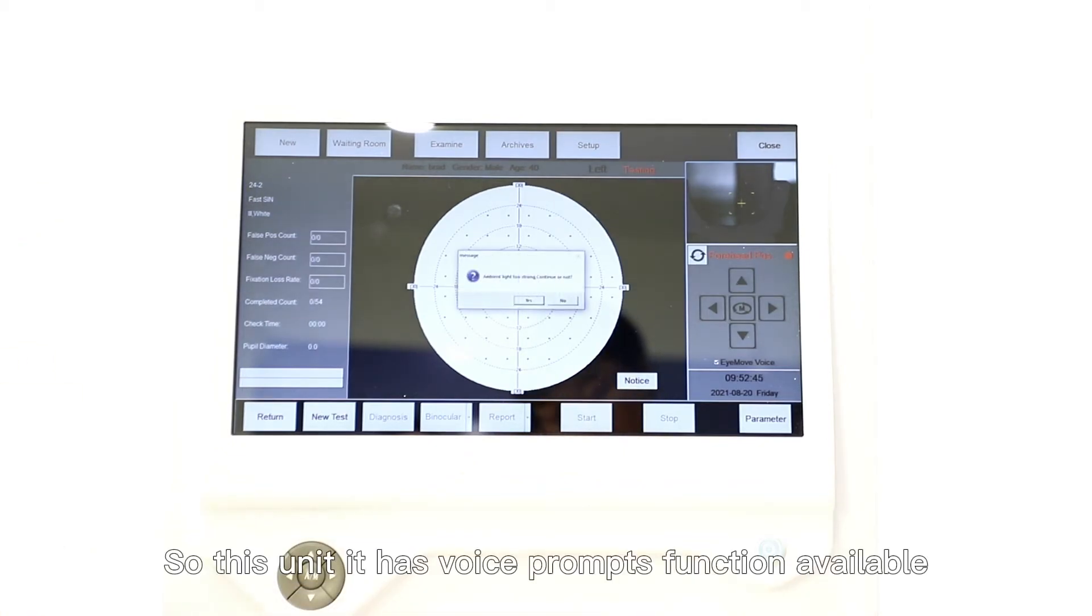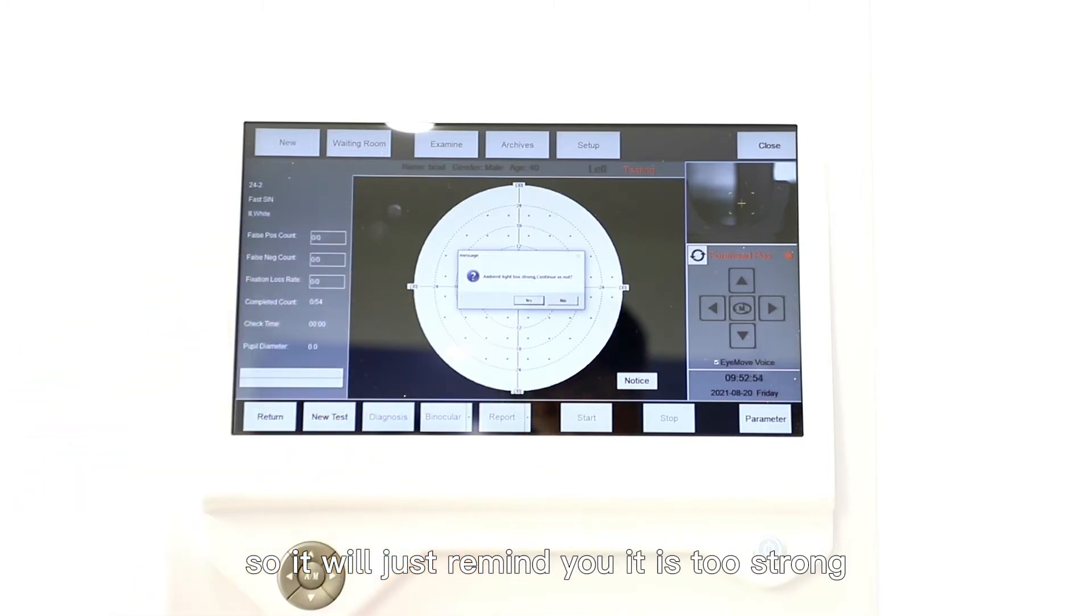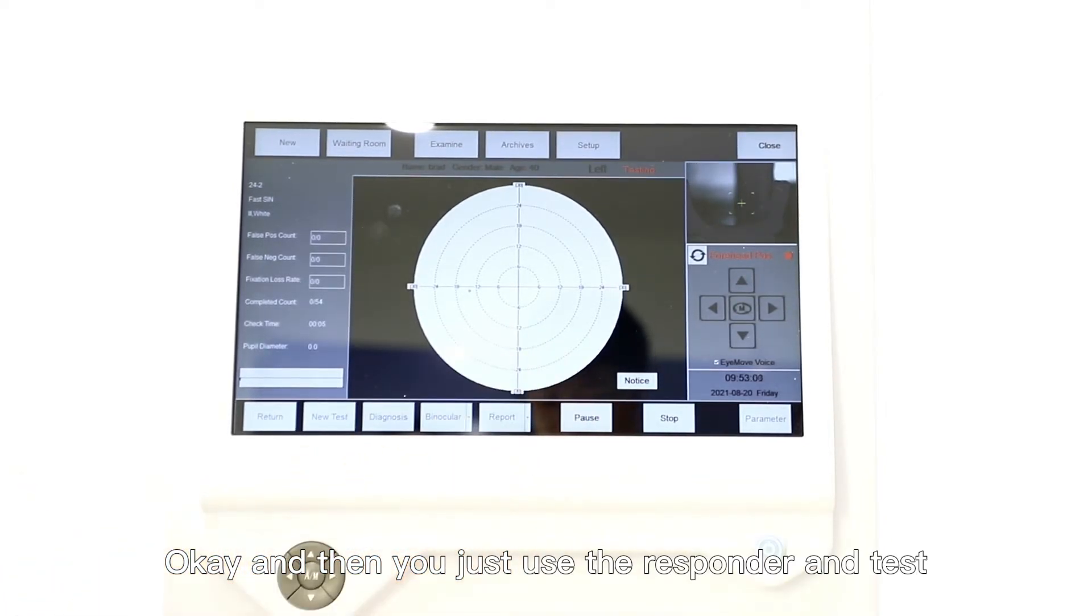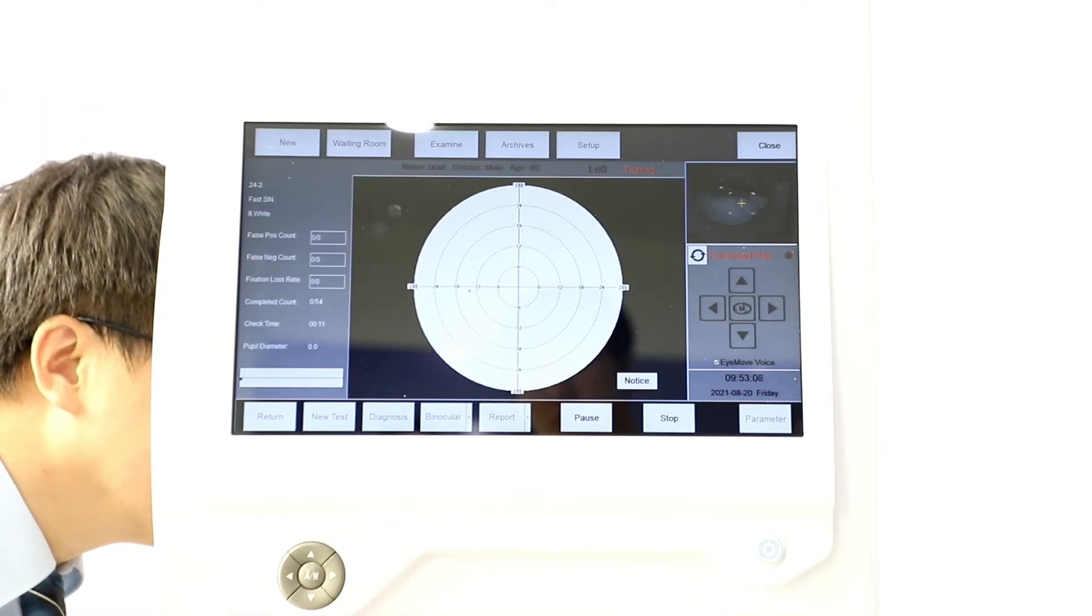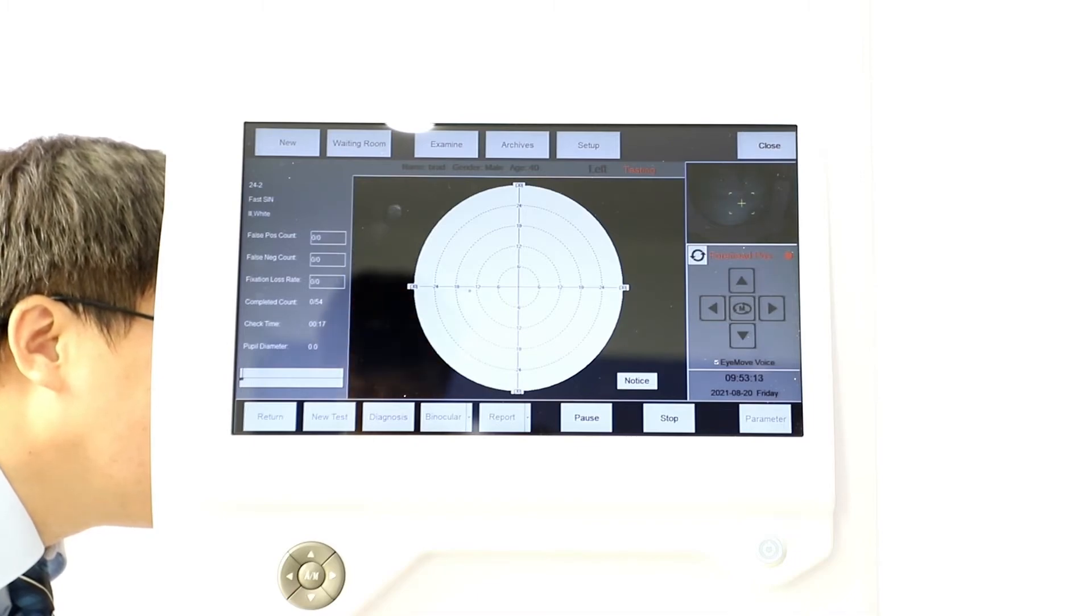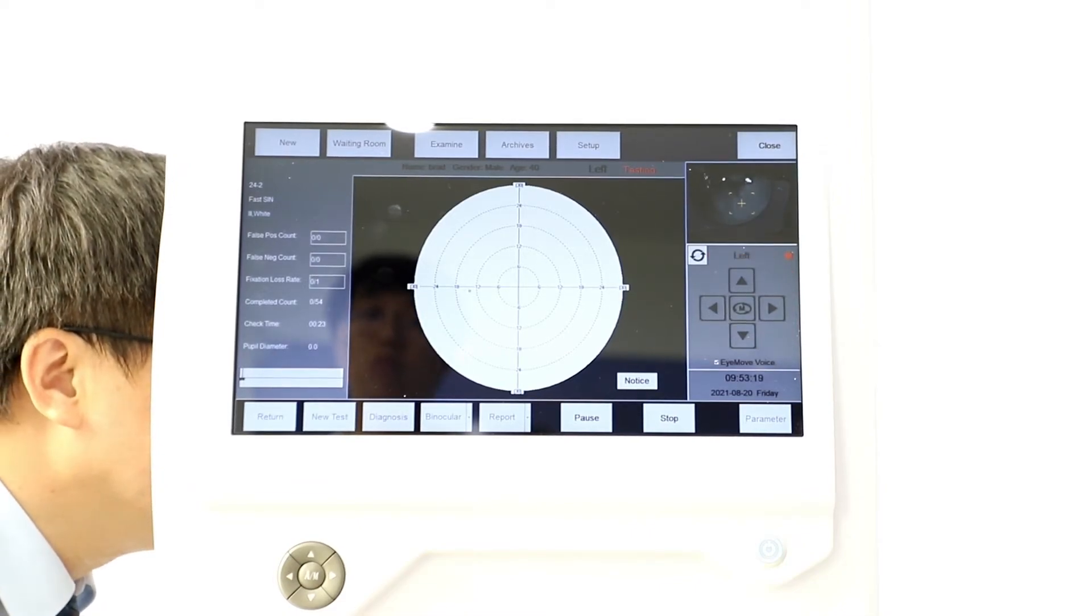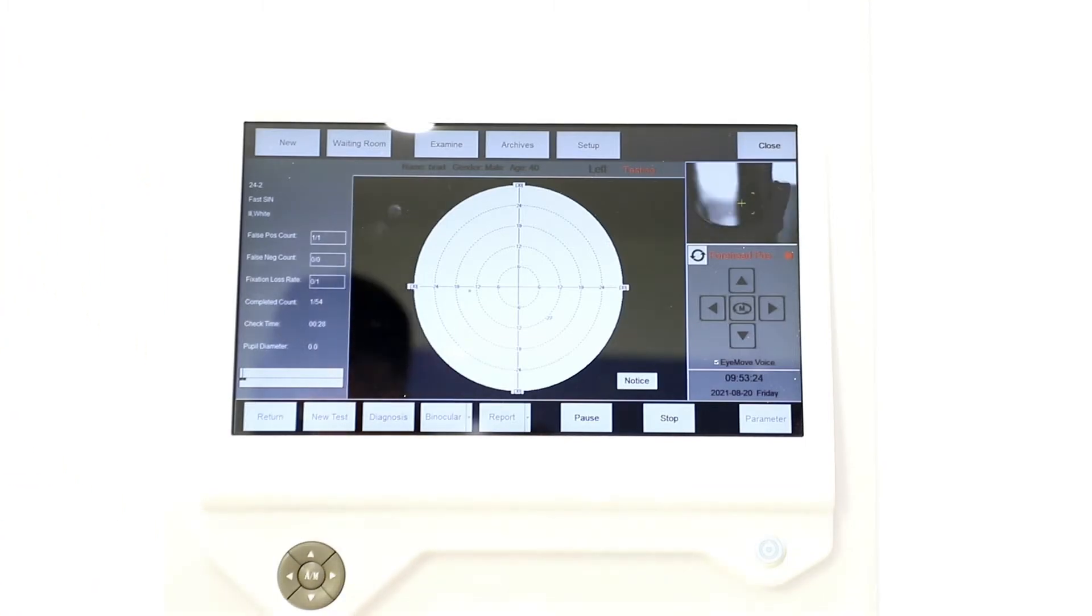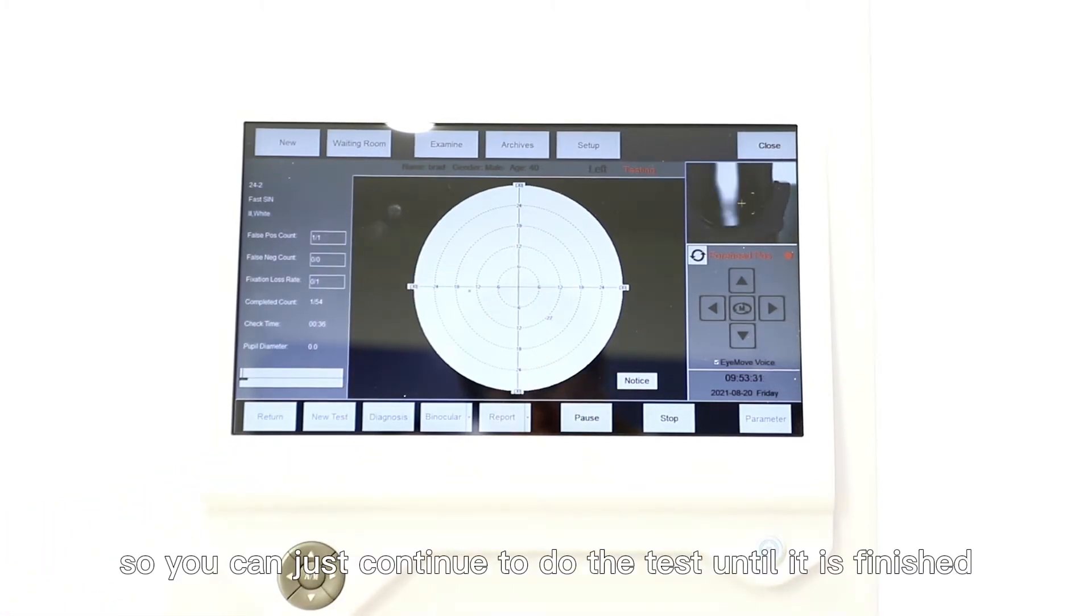This unit has the voice prompts function available. Because right now the ambient light is too strong, it will remind you it is too strong. Then you just use the responder to do the test. There are some values over here, so you can continue to do the test until it is finished, and then we choose Stop.